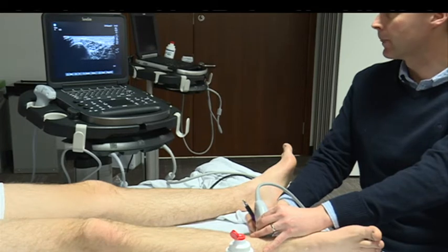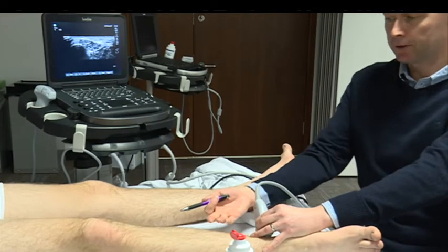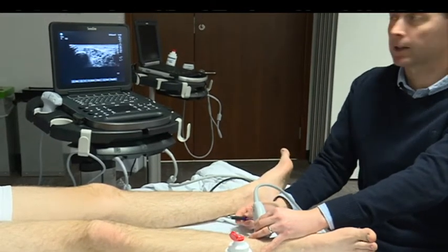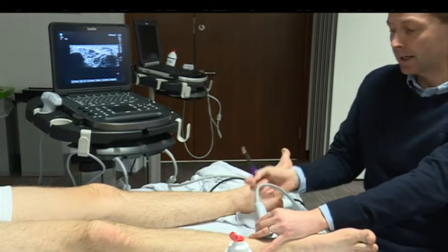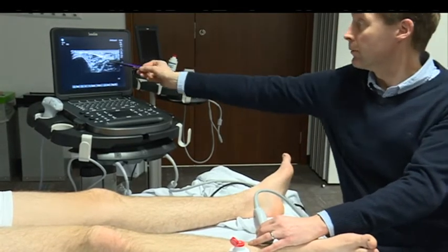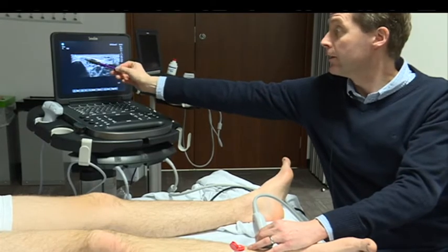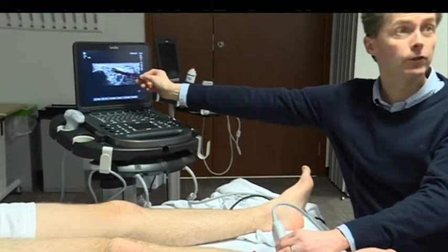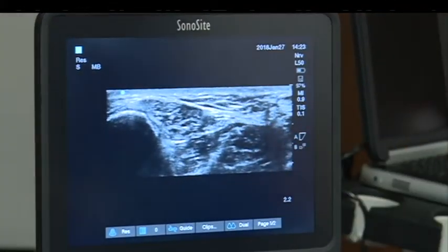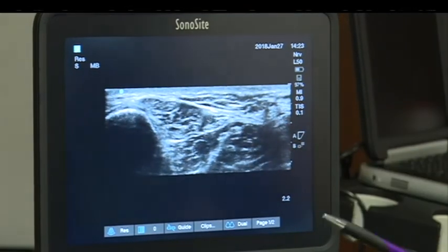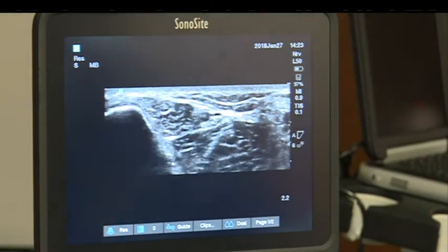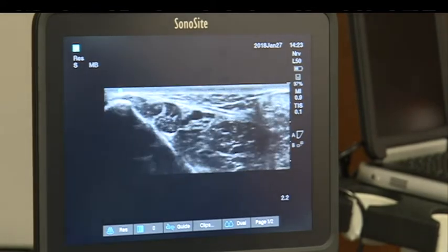To avoid needling through the Achilles, bring the probe a little bit further anteriorly. The natural angle would be to come in from the front, but this is where the tibial nerve is, and you've got two tendons here — tibialis posterior and flexor digitorum longus, the 'Tom and Dick' in the old mnemonic Tom, Dick, and Harry. The tendons are in the way, and so is the artery, so you have to needle from posteriorly.